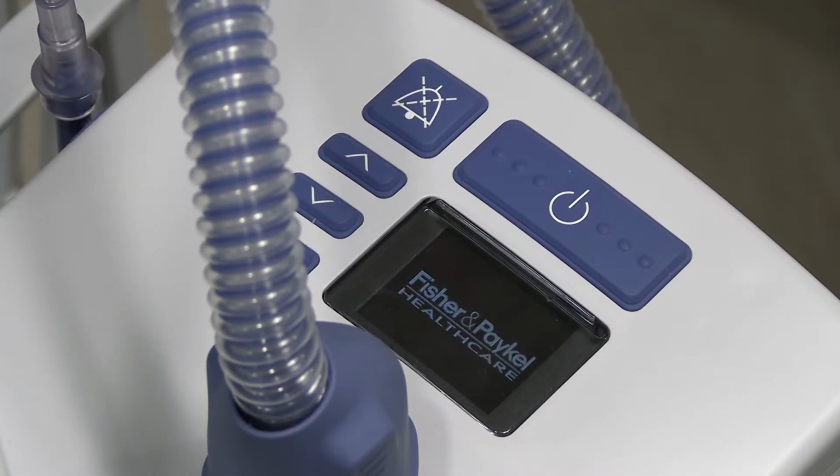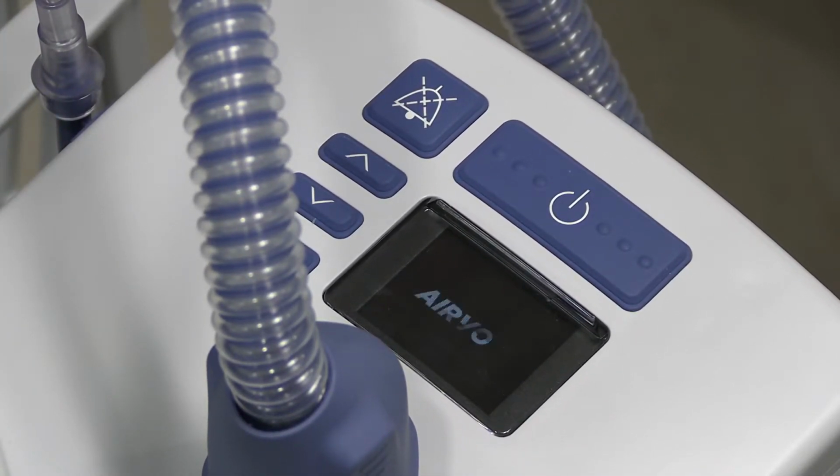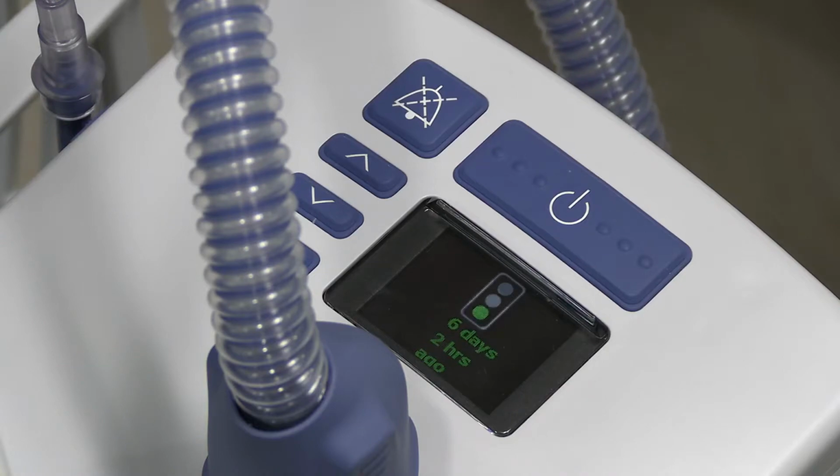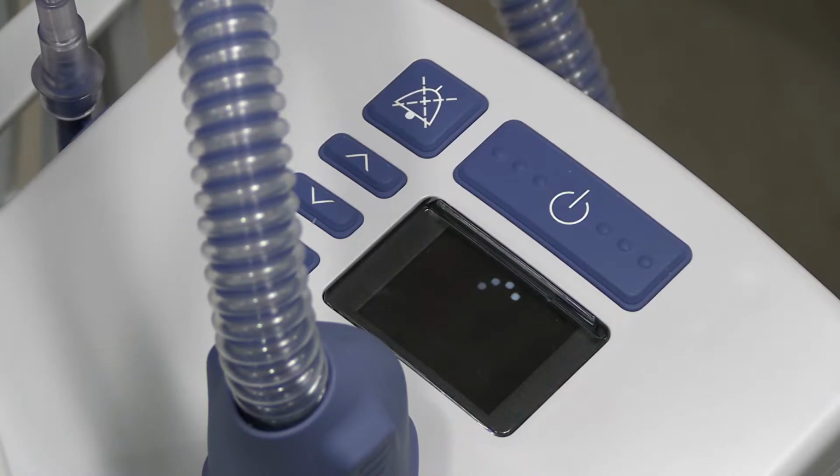Okay, so you'll hear the beep as we turn it on. You'll see the company name and the device name flash on the screen. And then it's going to tell you when the last disinfection was done, and it uses a stoplight feature to tell you that it's green, it's within the acceptable range. And now you'll see the circling star or sun. That is just telling you the device is now actually warming up. You can actually feel flow coming through the end of the circuit.